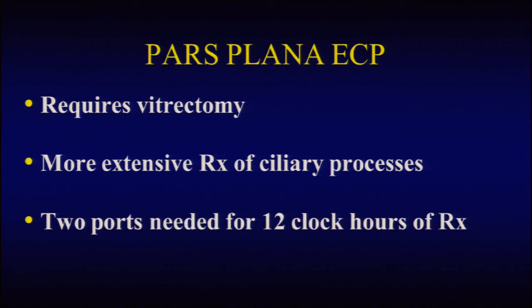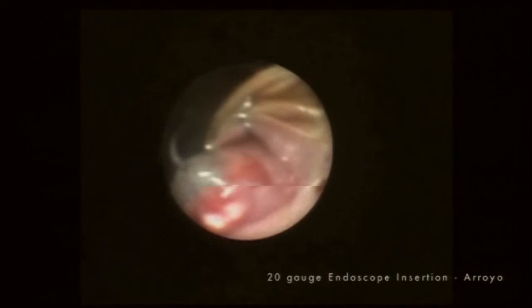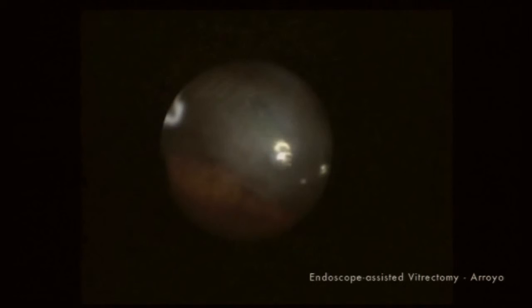This next case is a patient with a Boston keratoprosthesis with uncontrolled glaucoma. You can see through the biome view how clearly we can see the posterior pole, but unfortunately the view of the periphery is quite poor. In this case, the endoscope is focused and then introduced into the eye, revealing a significant amount of vitreous, which can then be safely and simply removed with a vitreous cutter. This patient had 12 clock hours of diode laser endoscopic cyclophotocoagulation treatment and had excellent postoperative pressure control.